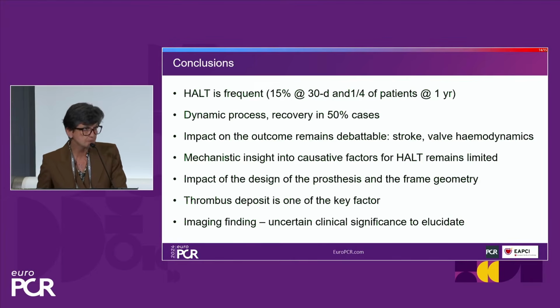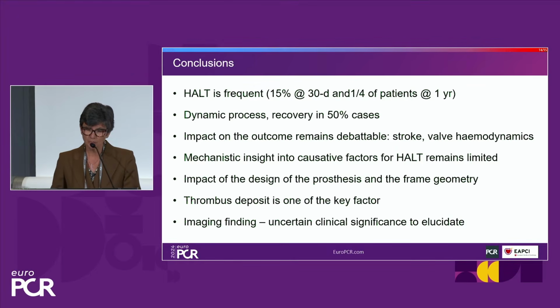So to conclude, HALT is frequent, approximately 1/4 of patients at 1 year, but this is a dynamic process with a recovery in approximately 50% of cases. The impact on the outcome remains today debatable, especially on stroke and valve hemodynamics, and mechanistic insight into causative factors for HALT remains relatively limited today.